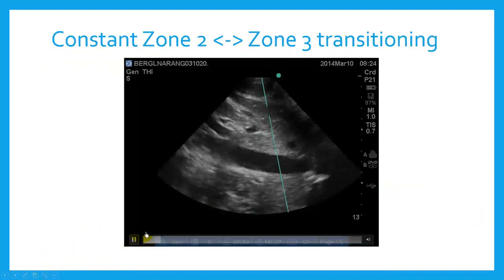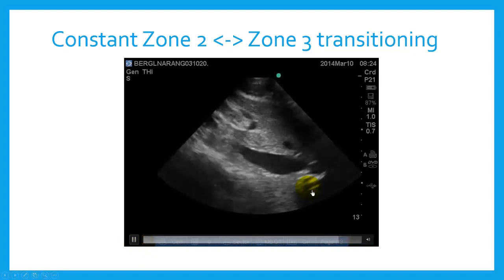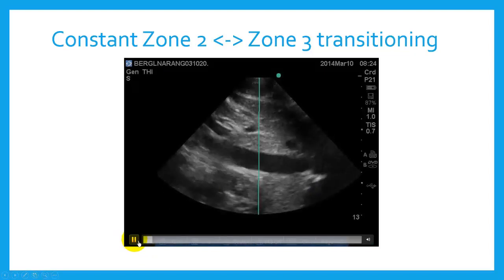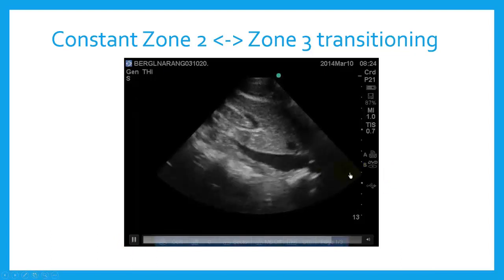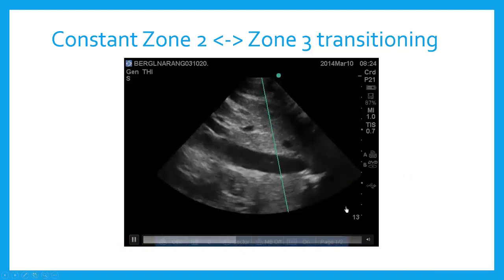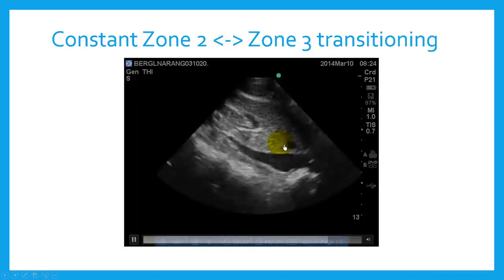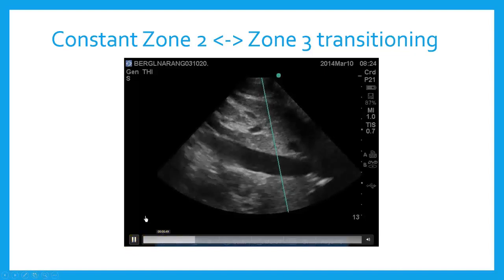And this is the example I gave you from the beginning. So this is my HFrEF patient with stage 3 CKD who's on the vent but breathing spontaneously with a lot of effort because he's got COPD and he's auto-PEEPing or something like that, and he's belly breathing, whatever that is. So I'm not sure how to interpret this because I can't tell you what the pleural pressure is at any given point in time. I can't necessarily tell you what the abdominal pressure is at any given point in time. So I'm not sure if this patient is going to be volume responsive or not.